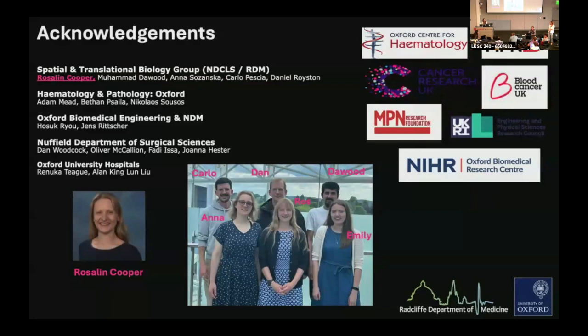Yeah, single molecule stuff. I asked Roz before I went to this talk because I thought that was going to be a question. And she basically said, you need a good pathologist who can choose samples. She's a pathologist, so it might be worth talking to her and she can talk you through. She's very talented at choosing the best quality samples, basically, EDTA for decalcification. So, essentially screening before. Yeah, that's basically what she said. You don't know any assay to pre-screen your samples before running? No, not that I'm aware of, no.